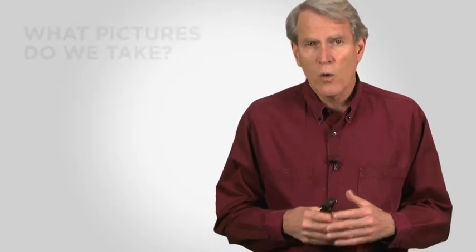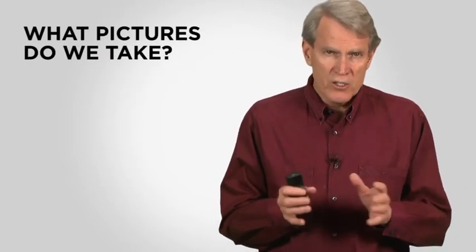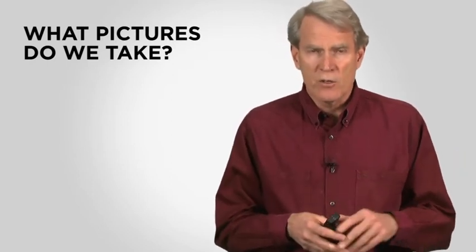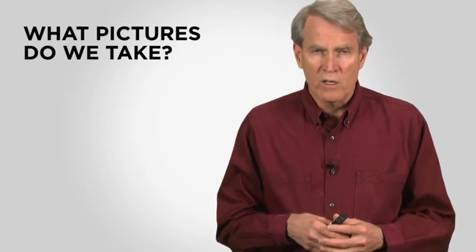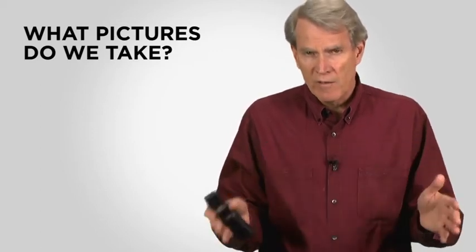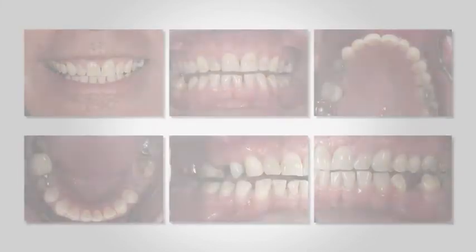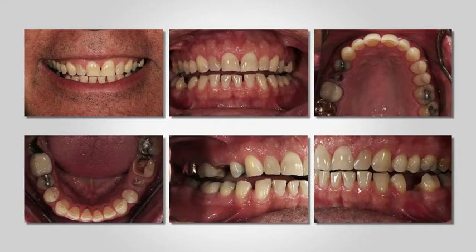Now the other thing is, what pictures do we take? Now this Lunch and Learn is accompanied by some other courses in our digital suite that you can look up and follow as well. When we have people in our facility at Spear, we teach this series of 18 clinical photographs that gives us a complete diagnostic record for our patients. But I really think that there are 6 basic images that you can take routinely for your patients that will show them every surface of every tooth and allow you to really begin to have conversations that are meaningful.